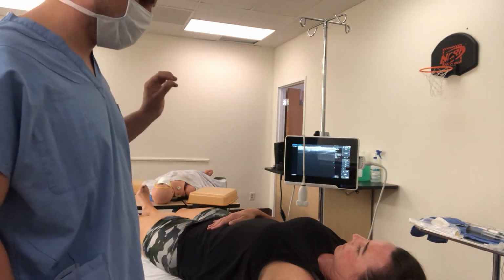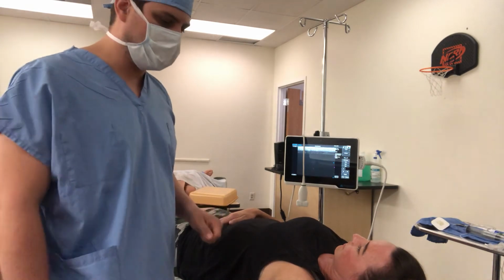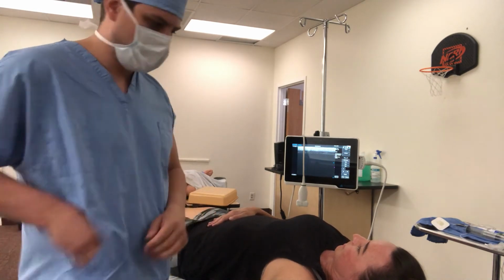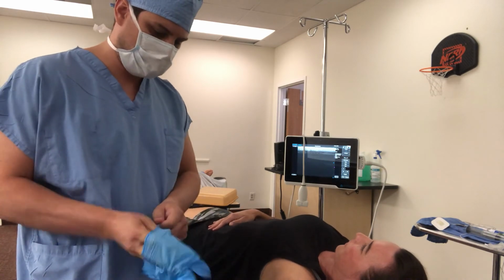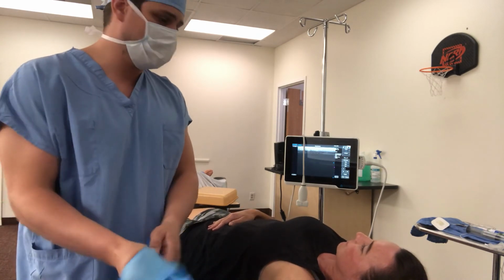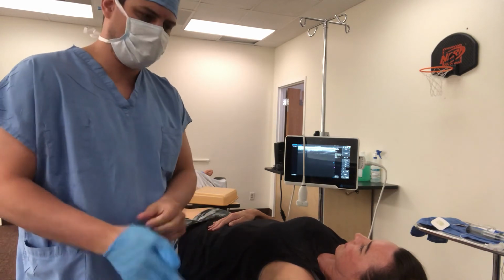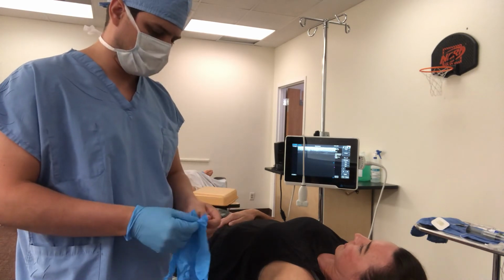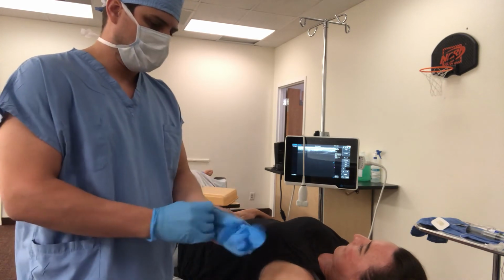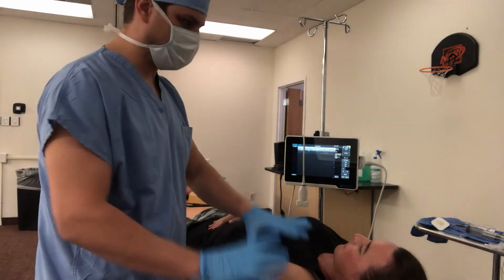I am going to sterilely prep her with chlorhexidine. I'm going to let that dry for a couple minutes. I'm going to put on sterile gloves in a sterile fashion. I'm going to put on my sterile drape. I prepped her with chlorhexidine. It's dried. The drape is on.